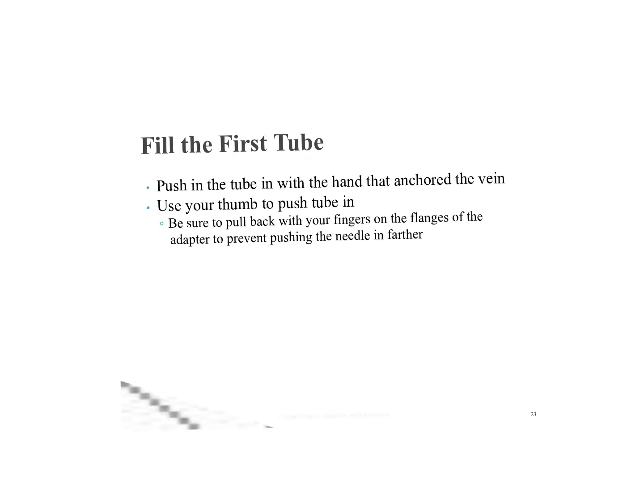We're going to fill the first tube, pushing in the tube with the hand that anchored the vein. Use your thumb to push the tube in. Be sure to pull back with your fingers on the flanges of the adapter to prevent pushing the needle in farther.